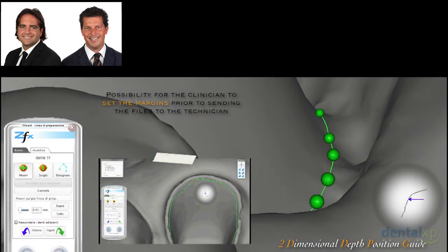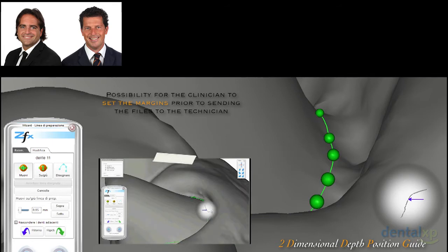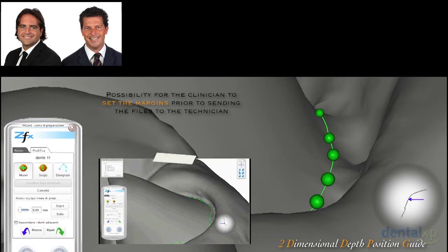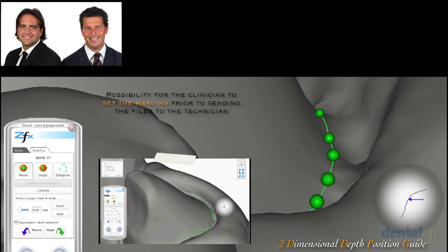In my personal opinion, one of the great advantages of this new technology tool is that it enables the clinician to define the line of the preparation of the abutment immediately, prior to sending the files to the technician.